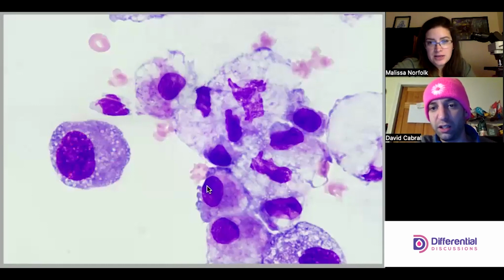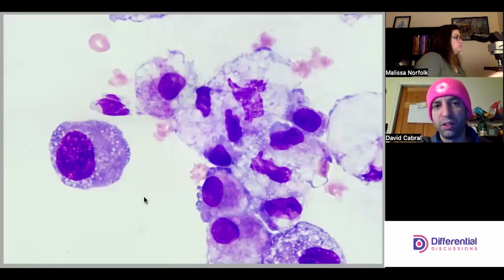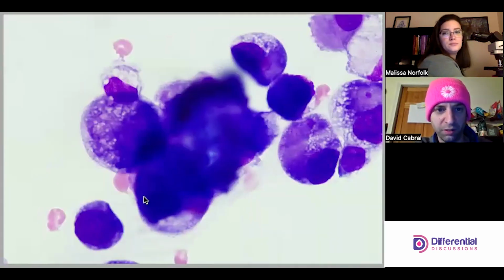Yeah. And I think these guys over here are more of like the mesos. I think that's probably true. Yes. And you can see the nuclear membrane is a lot more consistent. Yeah, more consistent than this. We're at least seeing some consistency in their general size and in the staining in the cytoplasm a little bit. Ooh, beautiful. Wow.